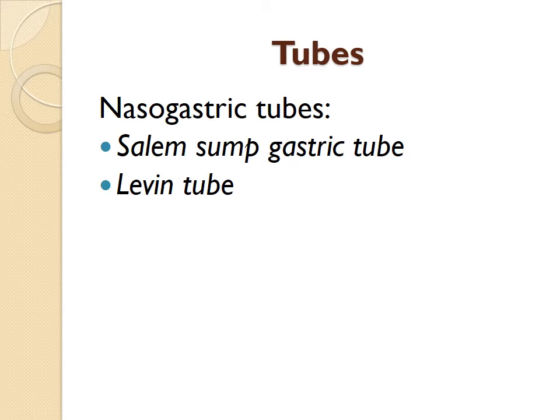Also with that Blakemore or the Minnesota tube, there is an area that will not only inflate in the esophagus, but another portion of the balloon will inflate at the top portion of the stomach cavity to allow it to stay in place easier.